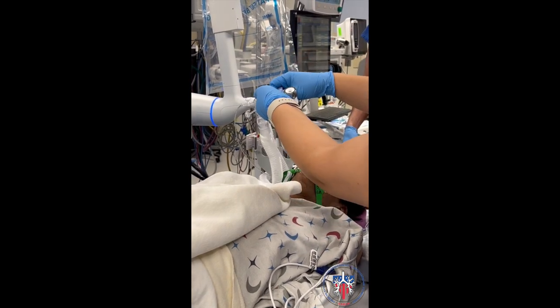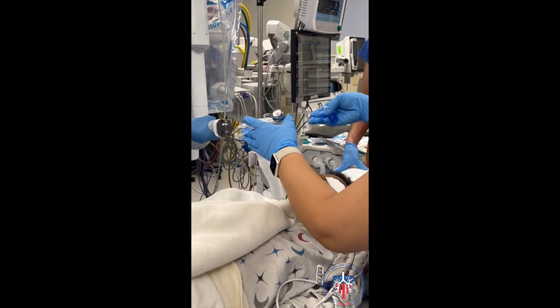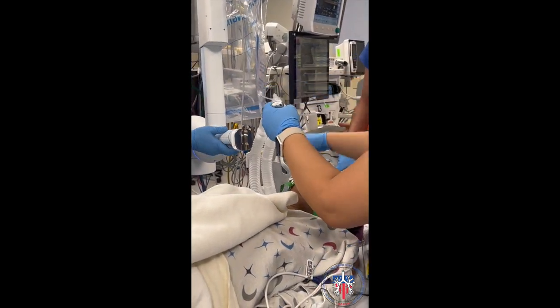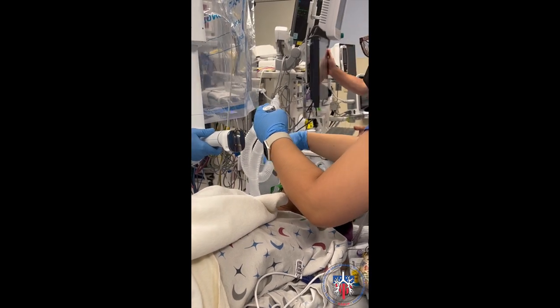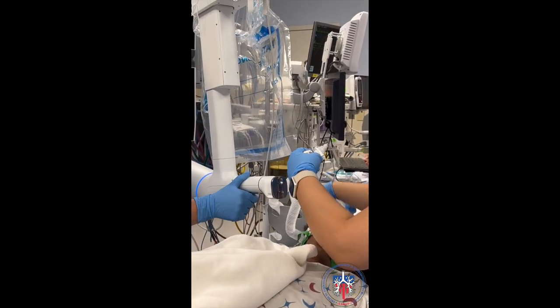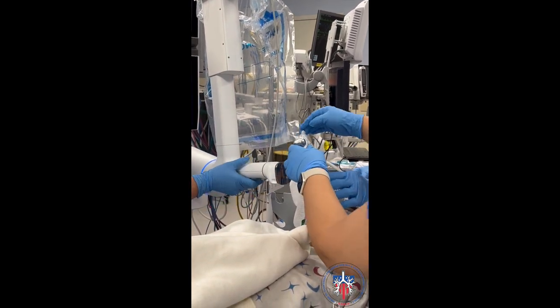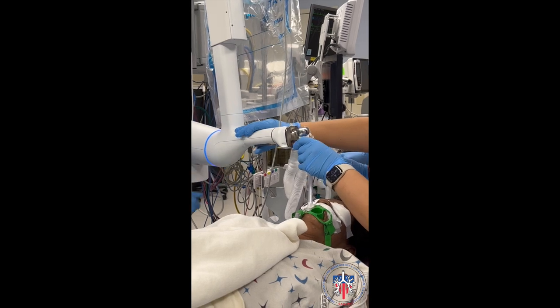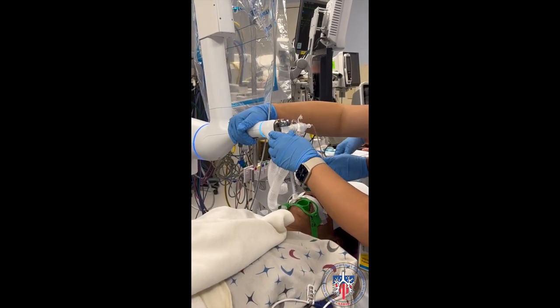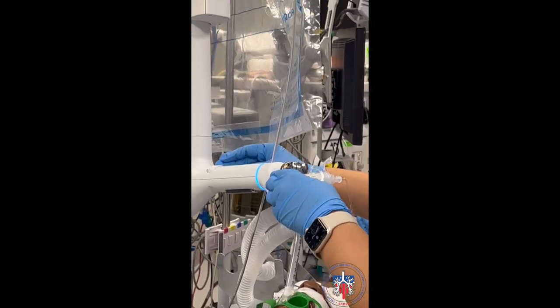Once the patient has been intubated, the ET tube is secured in place. The arm clutch is pressed for 3 seconds to mobilize it and attach the ion system specific swivel connector to the docking arm. The patient is placed on any fluoroscopy compatible bed before intubation. Make sure to relieve any tension in the arm so that there is no detachment during the procedure. Any detachment mid-procedure will require re-registration and restarting the procedure.